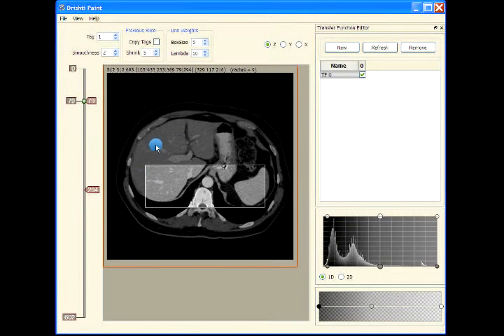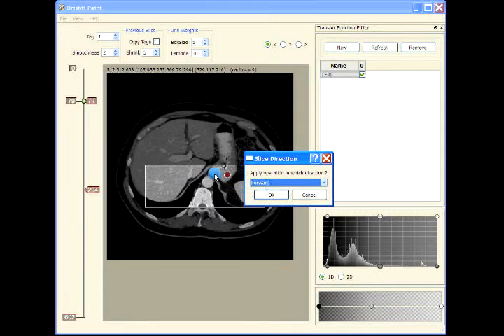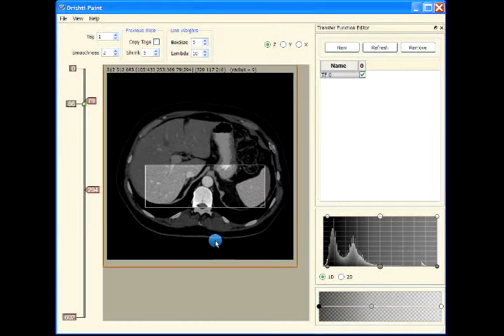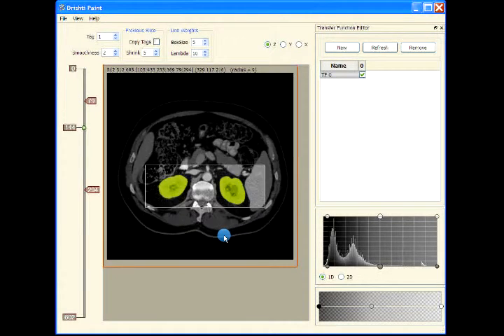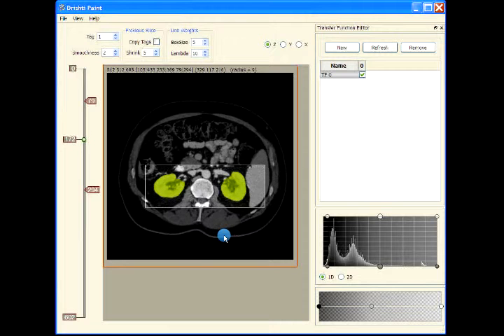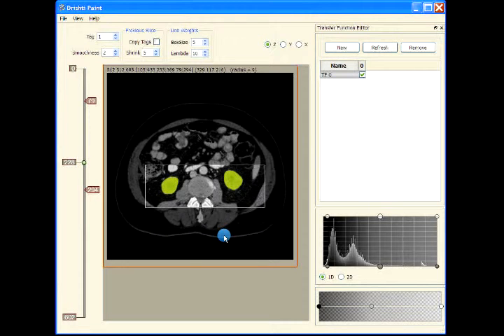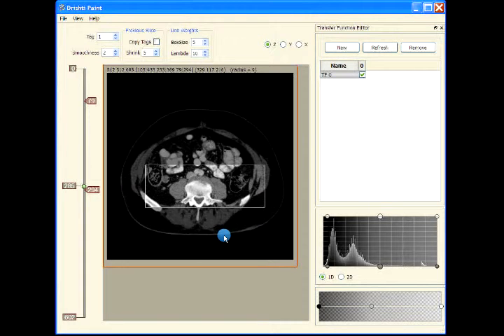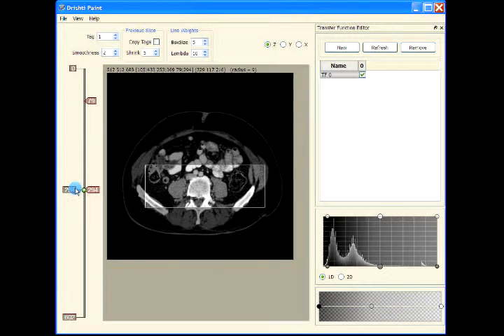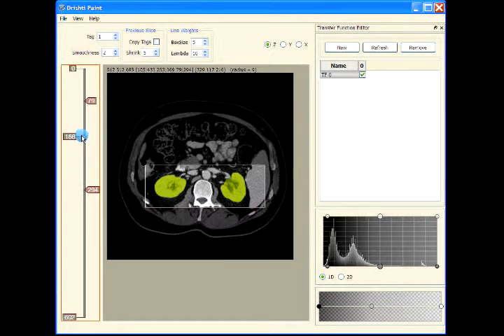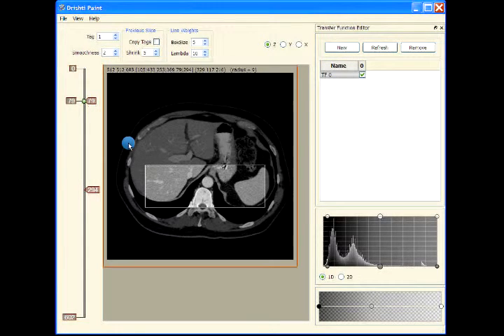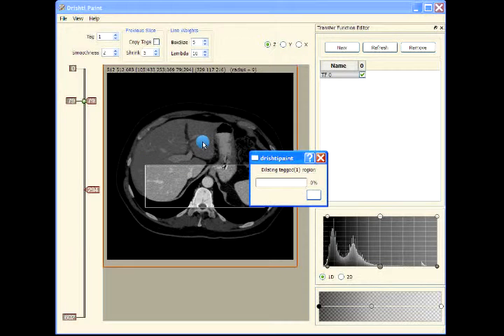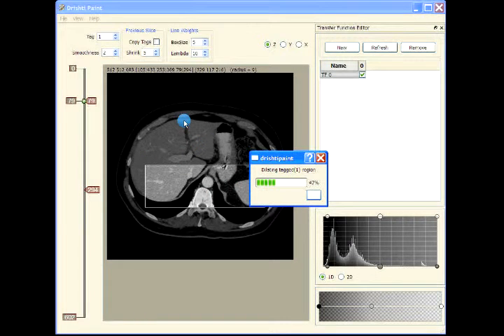Let me just erode that. In the process of dilation and erosion I have applied smoothing. Ctrl+D is dilating the tagged region and it goes much faster.